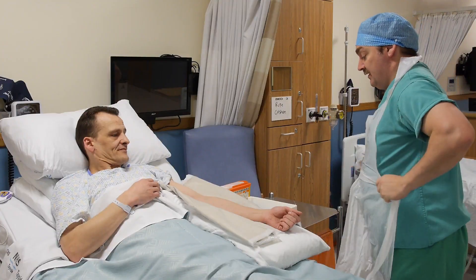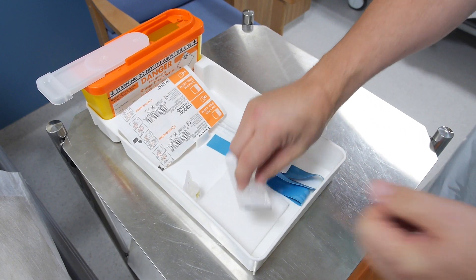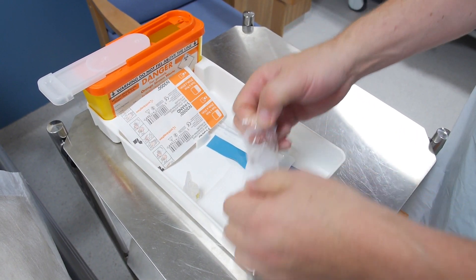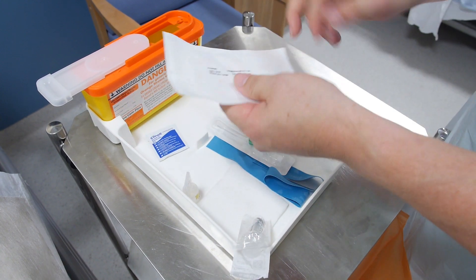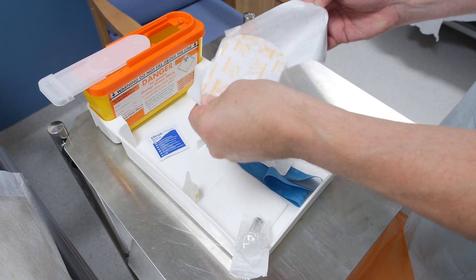Having prepared the patient, don a disposable apron and ensure all the necessary equipment is in position. It's important to be organized, so open and prepare a syringe and then a sterile waterproof dressing.